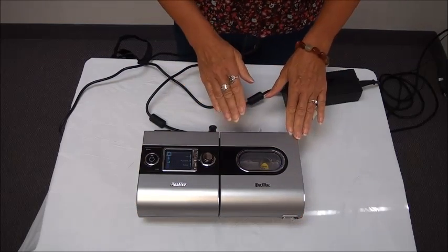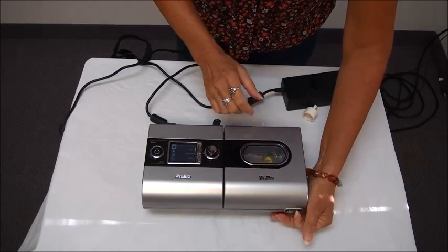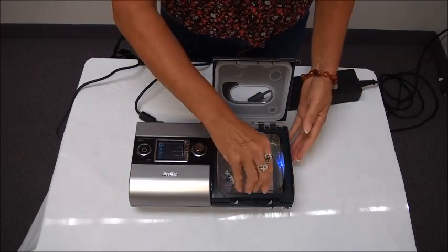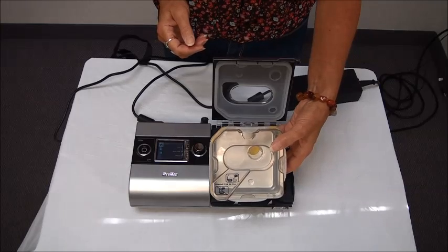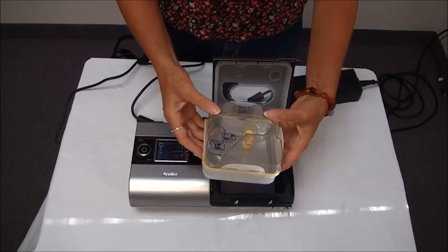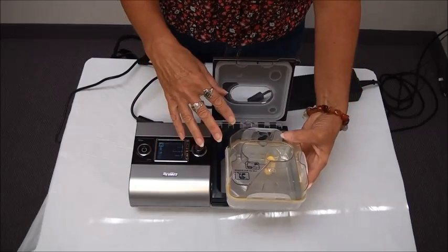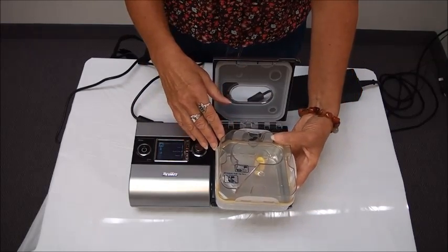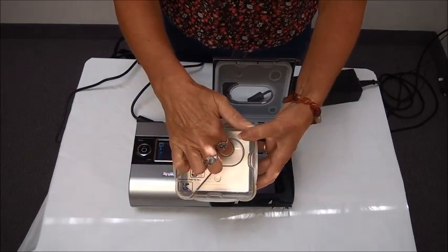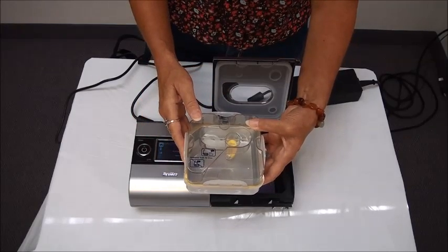Now I'm going to show you the humidifier. There's a little button in the front — if I just push this over to the side the cover will come open. There's a reservoir inside that needs to be filled with distilled water. You always want to use distilled water, not tap water, in your humidifier. You'll always want to take the reservoir out to fill it so you don't spill any water inside the machine. There's a hole in the top that you can fill it through, and if you look inside there's a little yellow piece with a max fill line and you never want to overfill your reservoir.